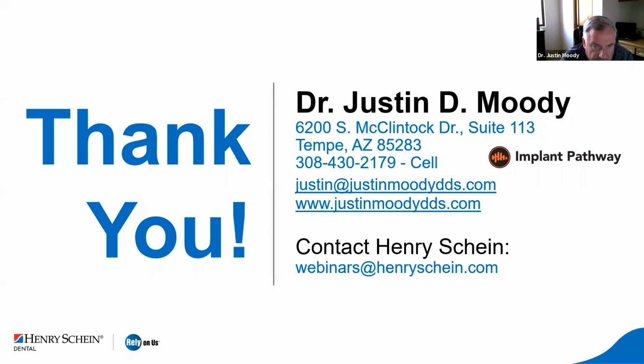And in the aesthetic zone, there's still a lot of application for sending to a good laboratory, because matching against other front teeth or doing one solo front tooth is always the hardest thing in the world. I do a lot of zirconia cores with hand stacked GC Initial line porcelain. So not only do we do all the above, we do in-office milling. We send to laboratories in different fashions.